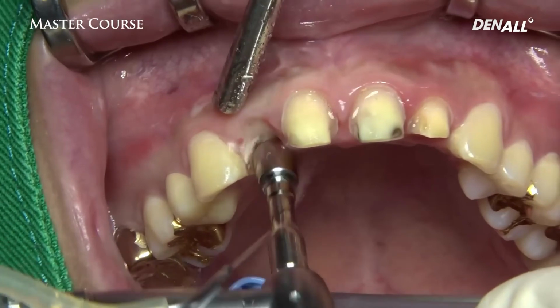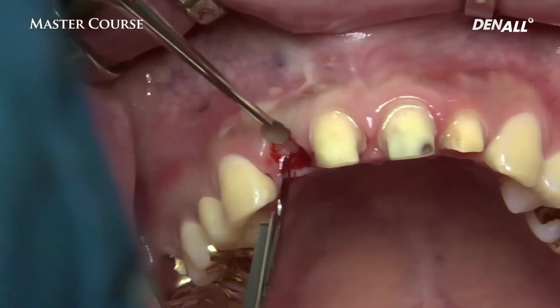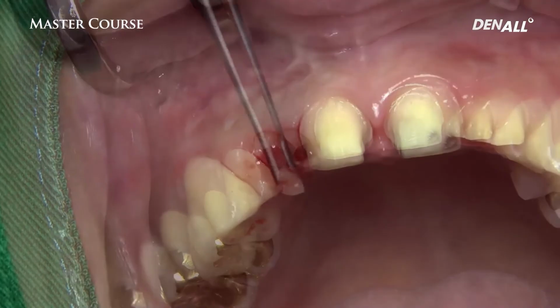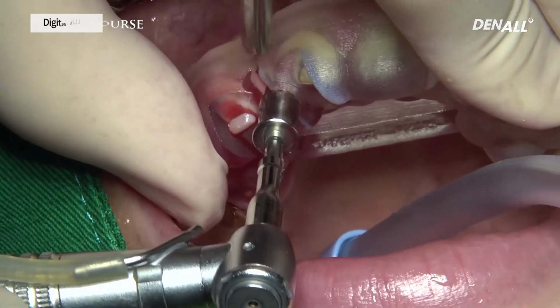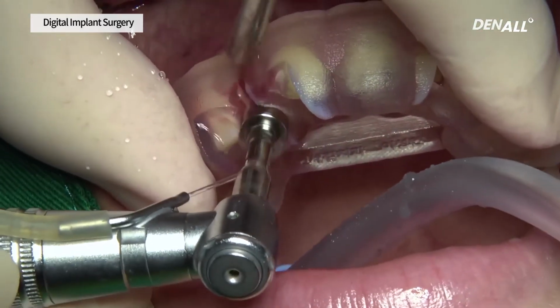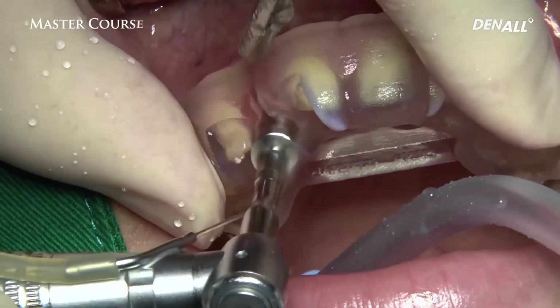So flapless surgery is planned for placing implants. By doing flapless surgery, we can position the implants as planned, and for that, the best solution would be One Guide surgery. A tissue punch is used to remove the top tissue. After mounting the OSSTEM One Guide template, sequential drilling is performed.